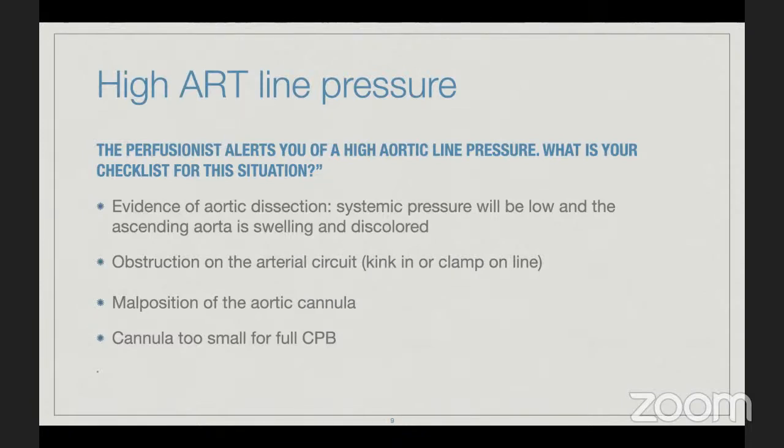There is a special sheath, basically a condom, to do it, and then you put water inside and just check, and you will see the whole aorta, all walls, anterior, posterior and lateral walls. You will see where the cannulation is, so you can avoid it. So keep in mind, epiaortic scan is standard of care, and it's a class 2A indication to do it.